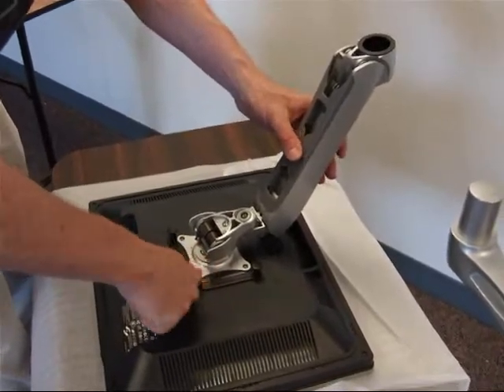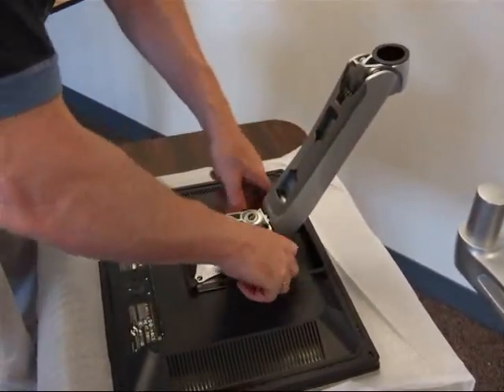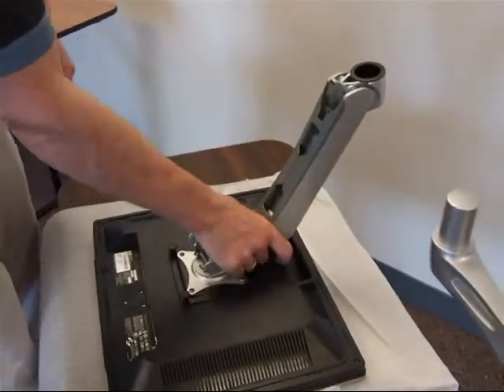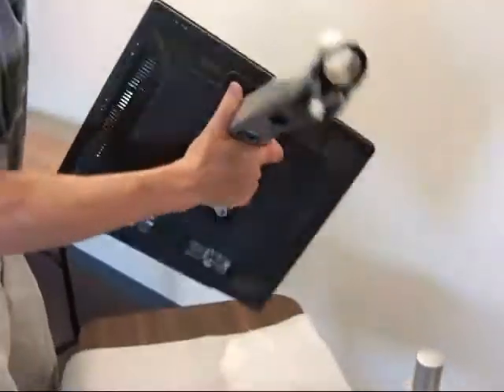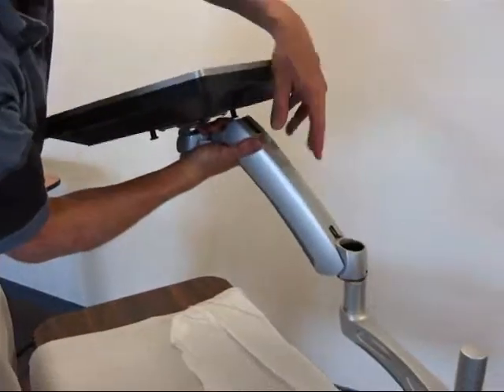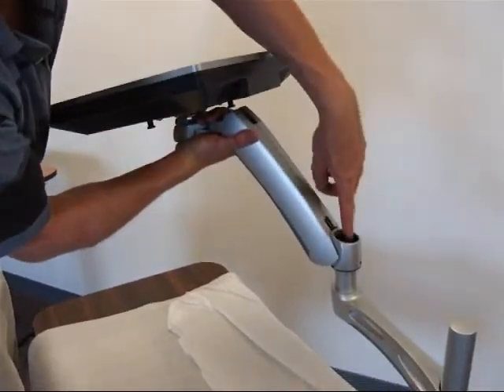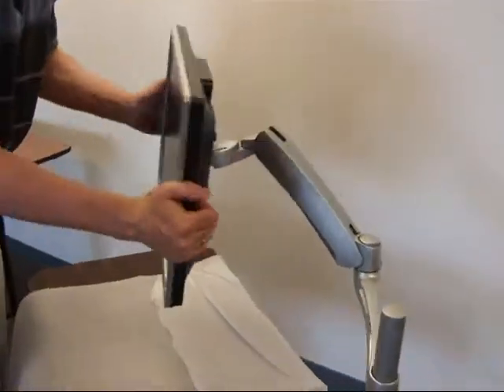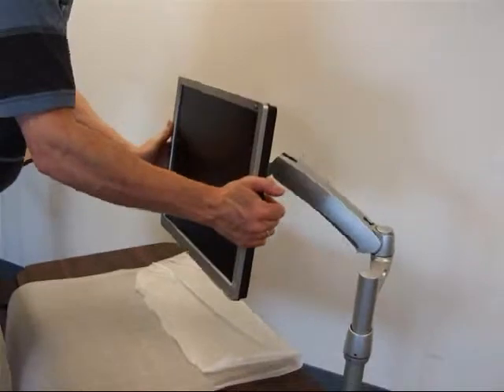Now with all four screws tight, I lift the arm here by its neck, take it up, and put it carefully into the notch on the middle segment of the monitor arm, and we're good to go.